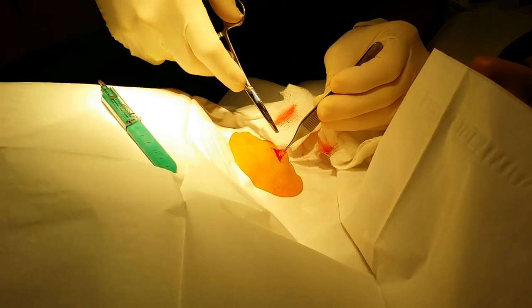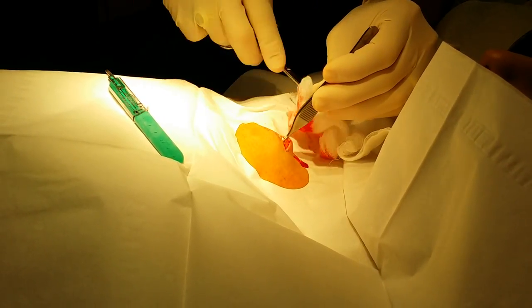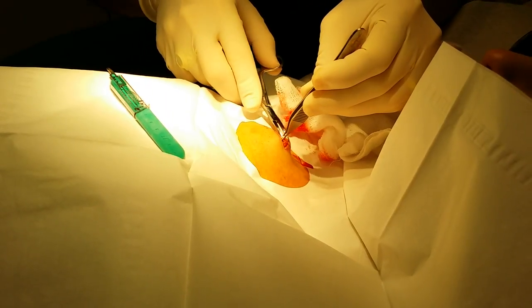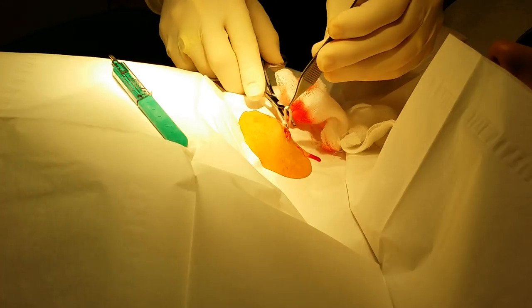We cut through it a little bit there to free it up on either side — that's perfect. Then once we get that tubing all cleared off and we can see it, we just start to pull it out.